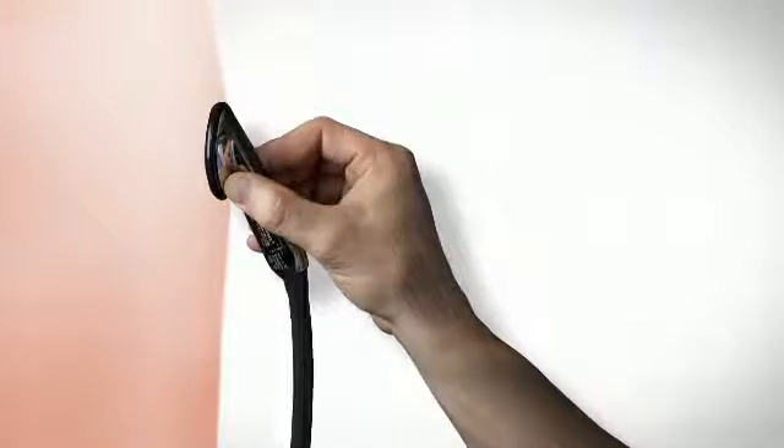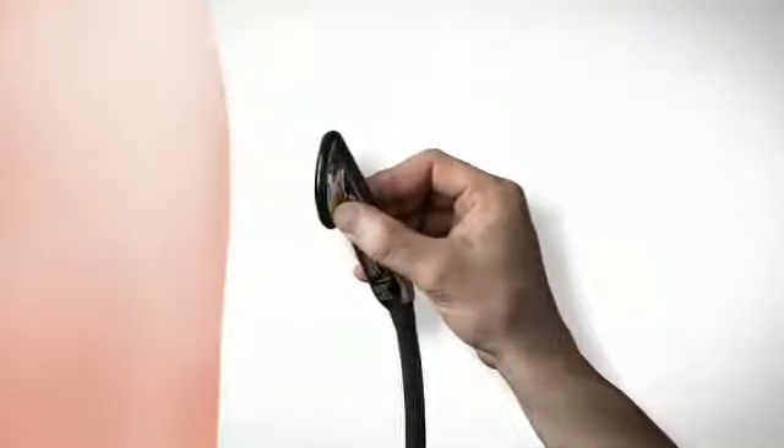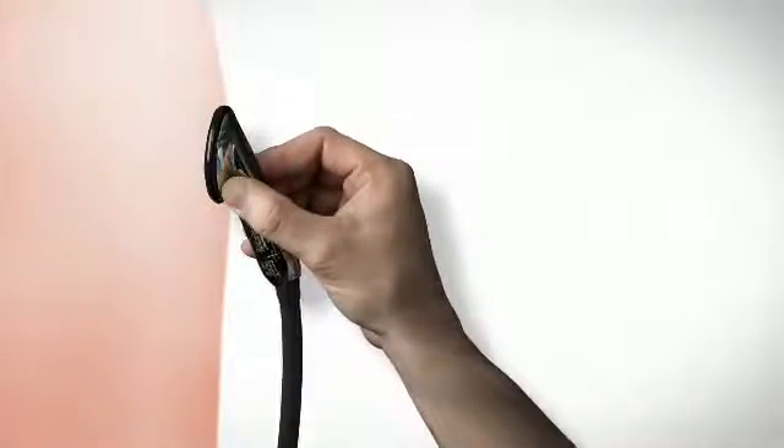You'll get the best results by using light, steady, and consistent contact with your patient. Minimize movement of the chest piece on the patient to reduce frictional noise.